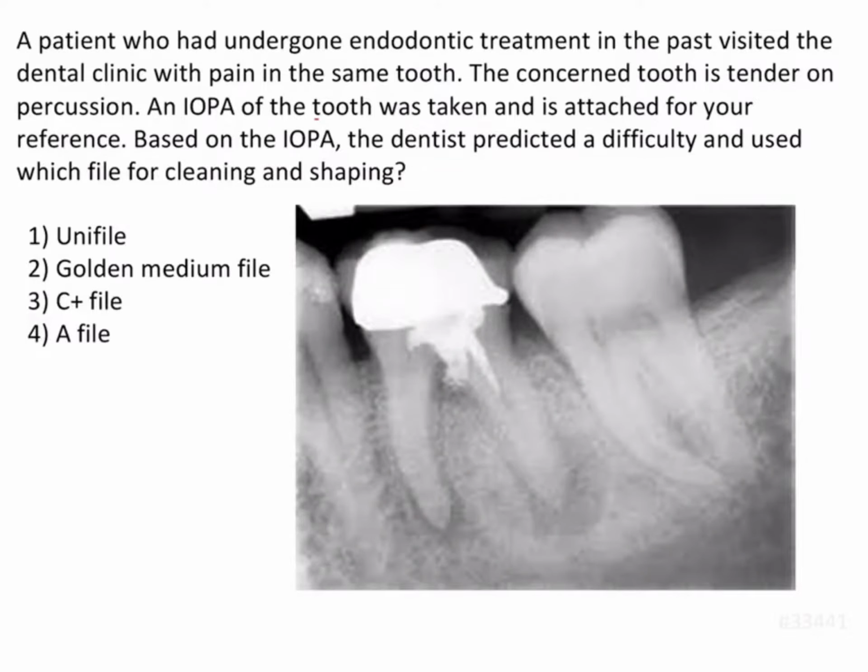A patient who had undergone endodontic treatment in the past visited the dental clinic with pain in the same tooth. The concerned tooth is tender on percussion, and an IOPA of the tooth was taken and is attached for your reference here. Based on the IOPA, the dentist predicted a difficulty and used which file for cleaning and shaping.